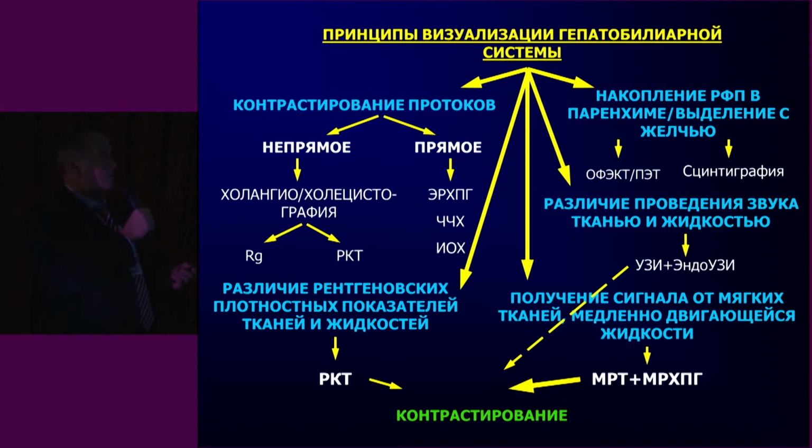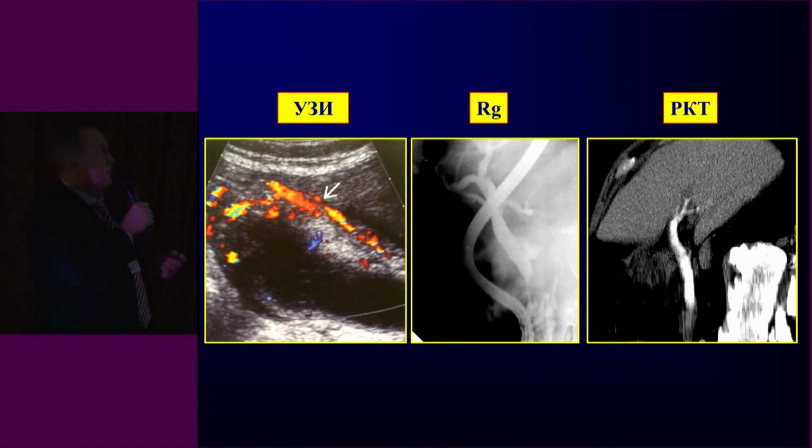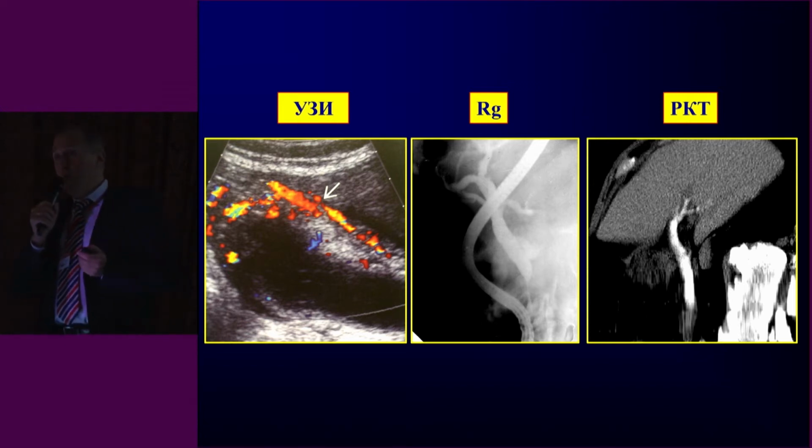Of course, we are more interested in those modalities being presented in the lecture, the ones you saw during the demonstrations: ultrasound, endoscopy, and of course conventional X-rays, and of course CT and MRI. We know the resolution which could be obtained with ultrasound.